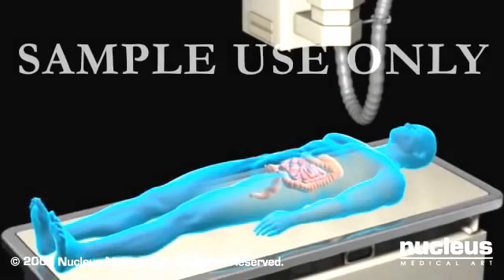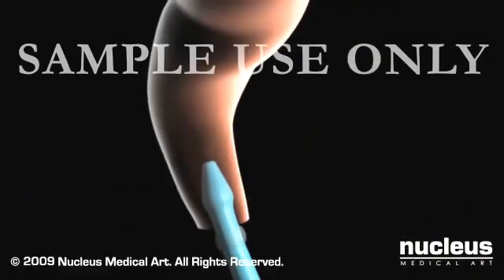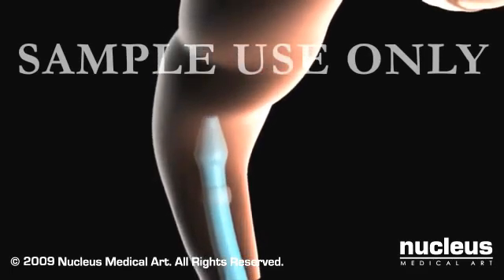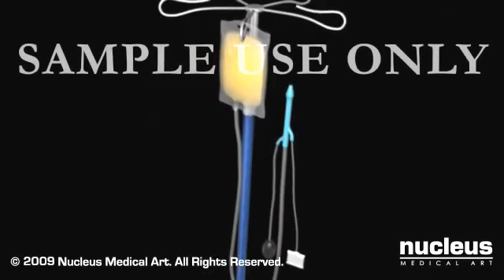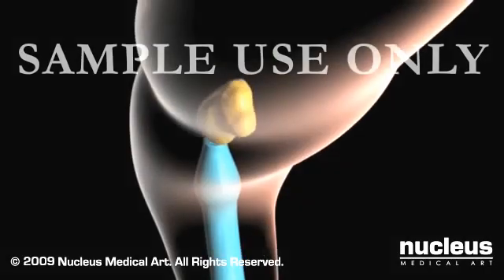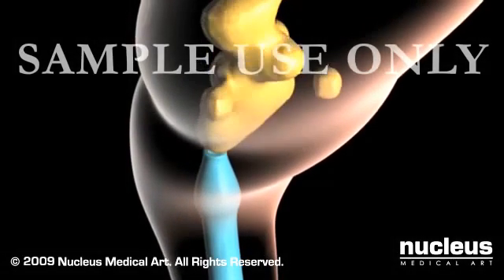Before the procedure, you'll be asked to lie down on an x-ray table. A lubricated tube will be carefully inserted into your rectum. A bag containing barium will be attached to the tube, and the barium will be allowed to flow into your colon.